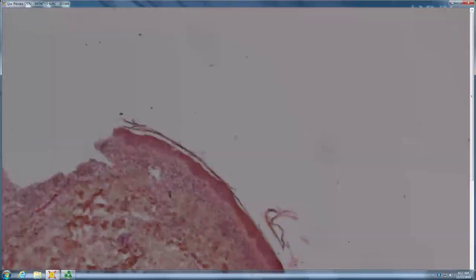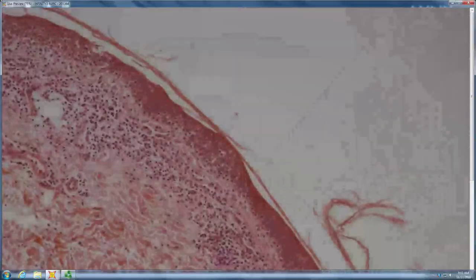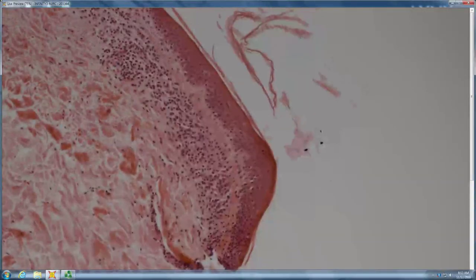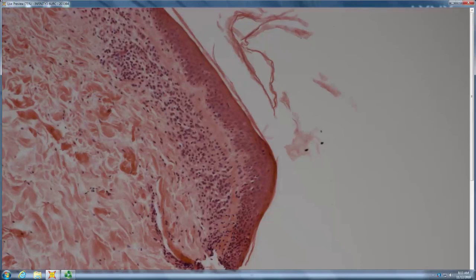So you got something going on at the junction there. What's going on at the junction? There's a lot of tagging, it looks like. Lots of tagging. And is it normal to have this kind of linear ropey collagen in your papillary dermis? No. So you said lots of tagging and linear ropey collagen in your papillary dermis. What are you looking at? MF. MF. Great.